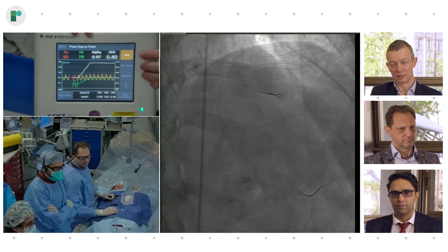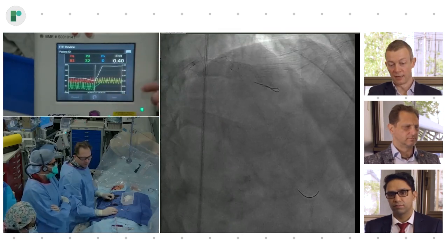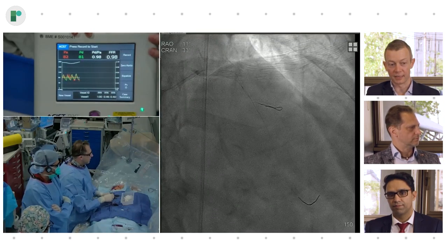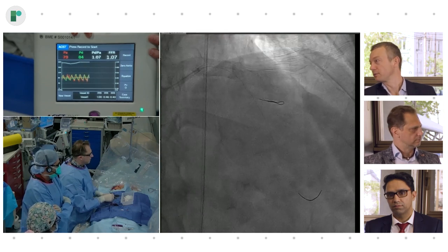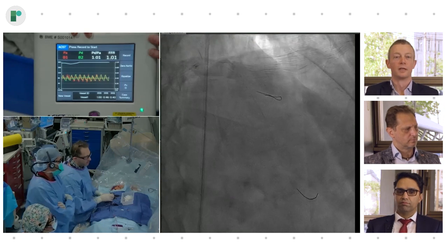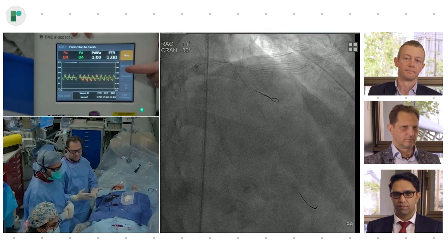I think that's a critical comment, and that's also what we've recently learned at PCR. IFR and FFR are initially identical, and the long term may be slightly different. But again, this is traffic light medicine, which is perhaps not contemporary. We use imaging more and more, to get a much better appreciation of the disease type, the diffuseness, and so on.